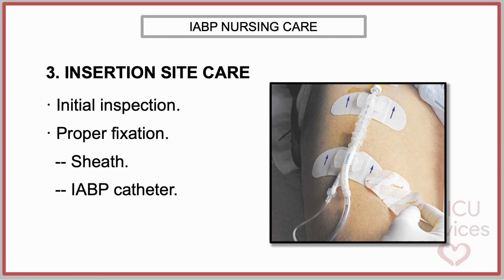These adhesive systems are designed to minimize catheter migration while distributing tension away from the insertion site. In addition to providing mechanical stability, they may reduce the risk of local skin complications associated with suture-based fixation, including inflammation, discomfort, and potential local infection at suture puncture points.